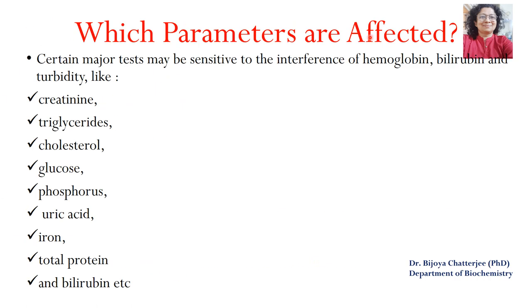Which parameters are affected? There are various parameters sensitive to interference by hemoglobin, bilirubin and excessive lipoprotein causing turbidity. These include creatinine, triglyceride, cholesterol, glucose, phosphorus, uric acid, iron, total protein, bilirubin and others. All these factors can be affected by the quality of the serum or plasma sample.